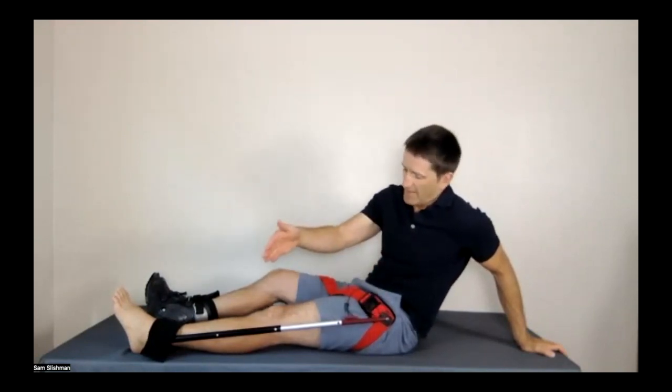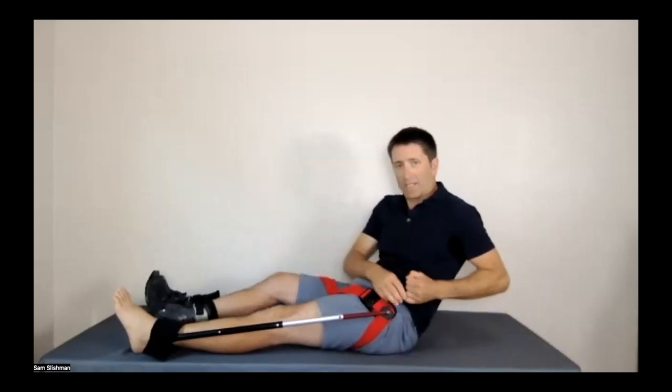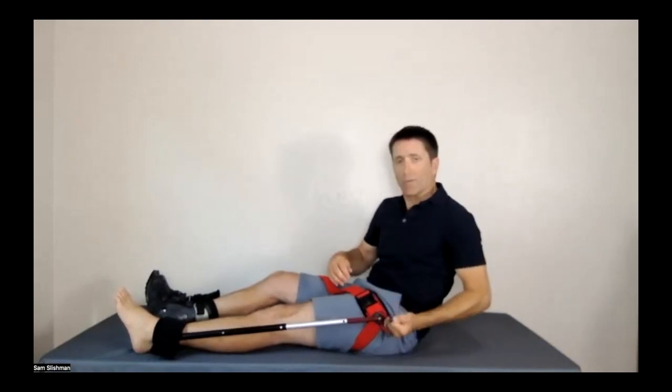So you'll notice there's no more thumb screws. It's just the cord that does the lock. And it's quite easy to adjust and readjust. Just pull and lock and then release.